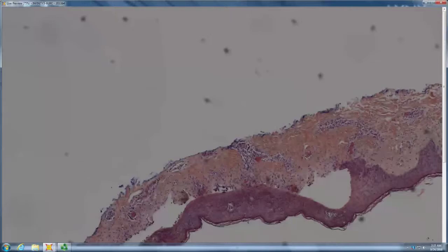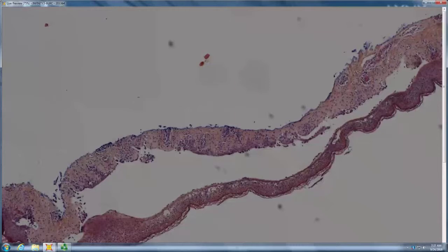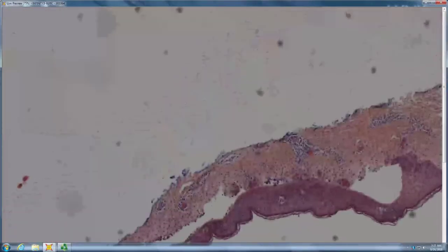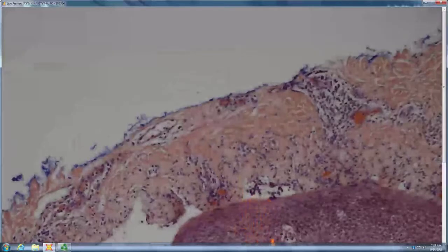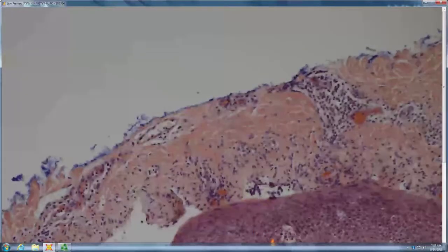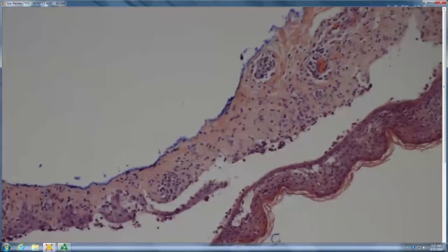We got a subepidermal split, some reepithelialization, and some necrosis of the epidermis. Think about PNP or EM. So EM, TEN, PNP. There are some neutrophils. That could be just because you have an old necrotic bulla that's become a little impetiginized. Or could it be immunobullous, and the epidermis becomes necrotic after it's been detached for a while? So it becomes chicken or the egg, right?